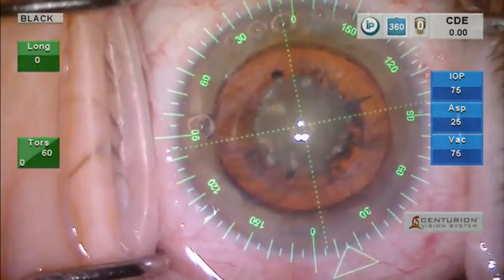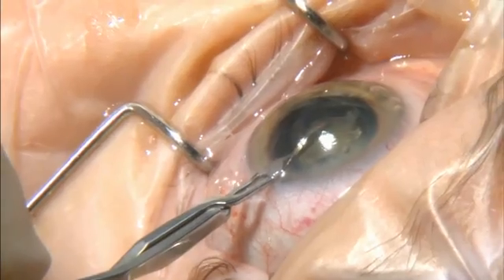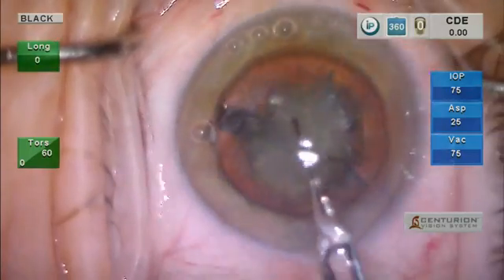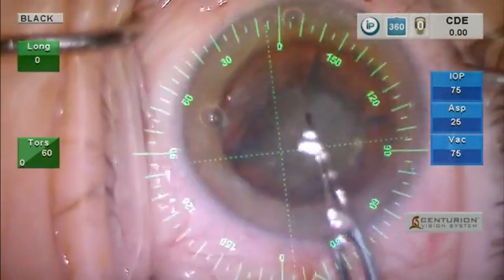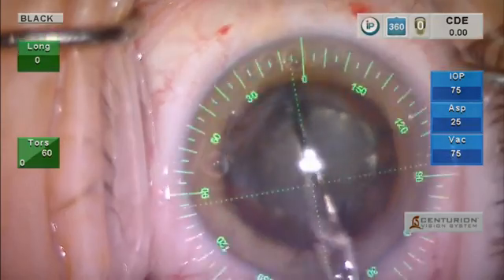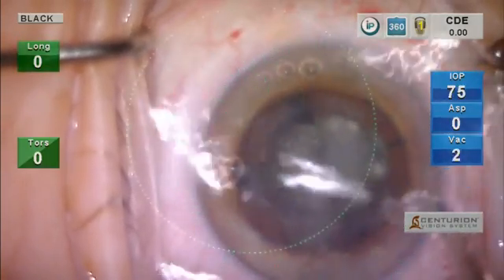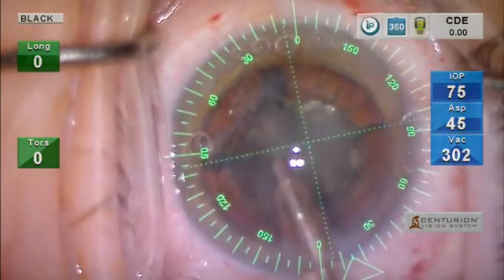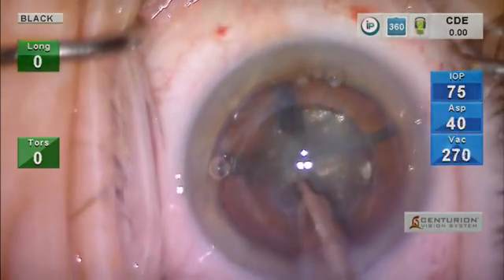I will take the pre-chopper now. We then enter with the pre-chopper and go into the area of the chop made by the femtosecond laser. I use four chops, which actually separates the nucleus into eight pieces, but I only use the pre-chopper in four of those and separate it into quadrants. If it's a very dense nucleus, I will oftentimes use all eight pieces for very small fragments. When I enter the eye, you can see there's a lot of debris and the anterior capsule is still there, so I will enter in foot position two where I have more vacuum and aspiration and remove debris from the anterior chamber.